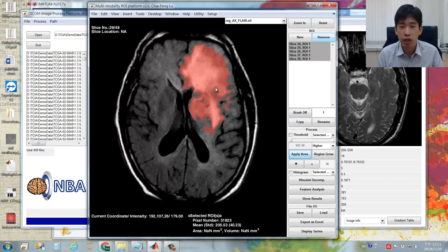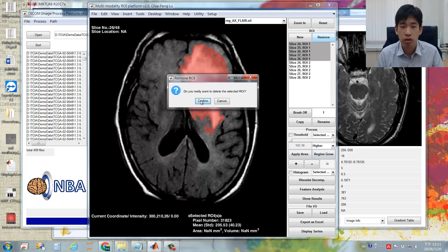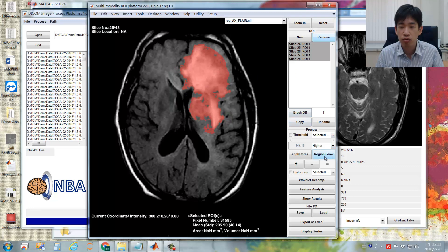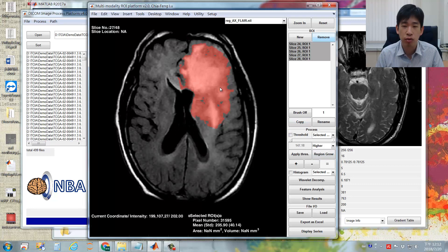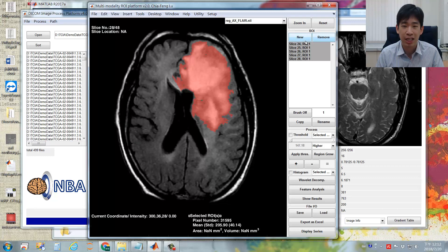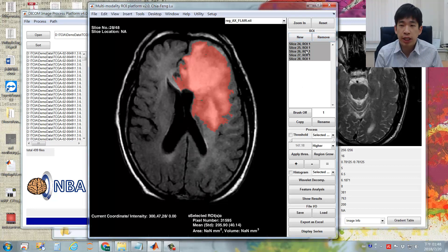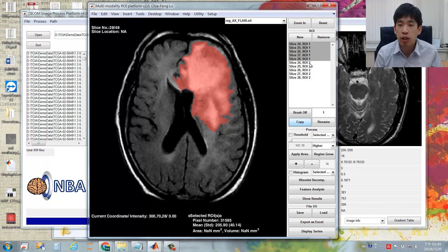Similarly, you can perform 3D region growing by selecting multiple ROIs, then clicking the Region Growing button, placing your seed points, and pressing Confirm. You will see that region growing is performed in a three-dimensional way, affecting all selected ROIs. You may also copy created ROIs by clicking the Copy button — the program will copy the original ROIs into another set, automatically labeled as ROI2.